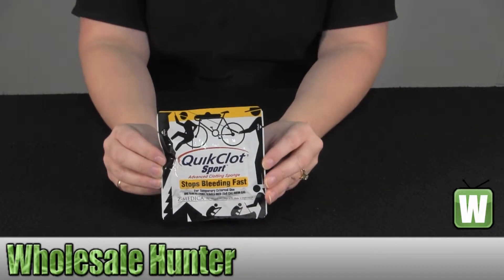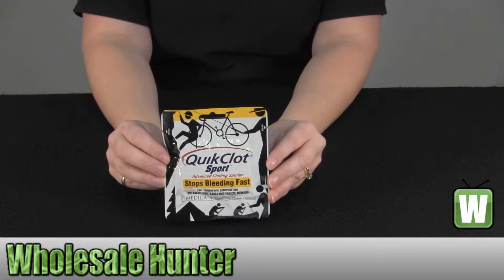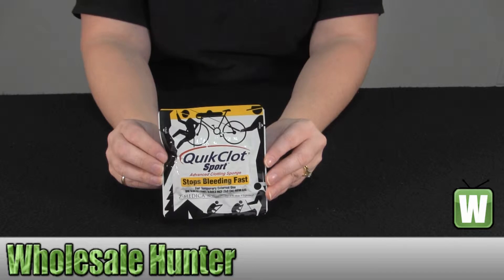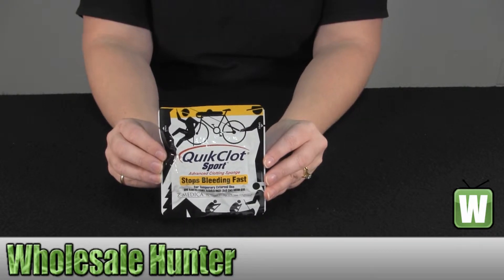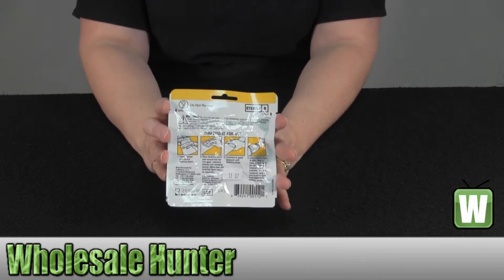Hello and welcome to the unboxing video for the Quick Clot Sport 25 gram made by Adventure Medical, manufacturer number 5020-0001. This is the package it comes in. There are instructions for use on the back of it.